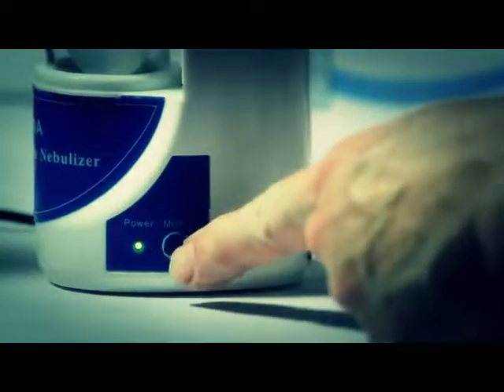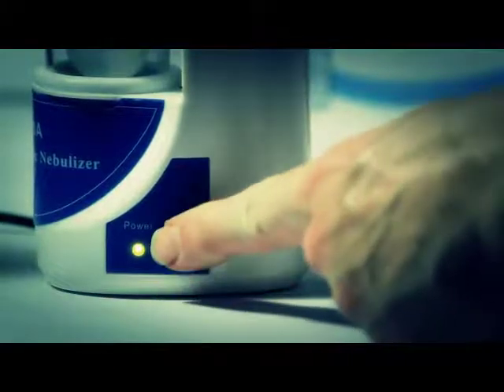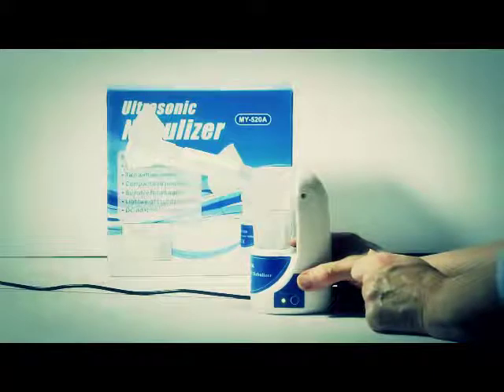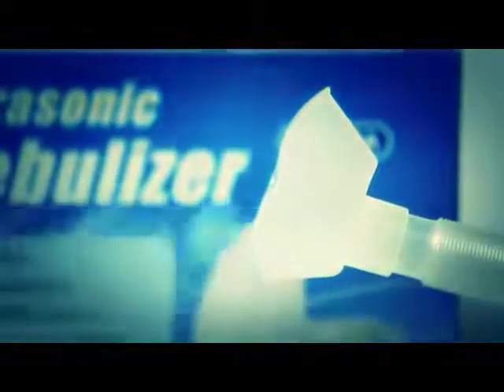To turn on the unit, just plug it in and press the power button. It has a low mode and a high mode. Be sure to rinse the containers before using and after using. You'll really enjoy this portable nebulizer because it's quick, it's easy, and it works great.